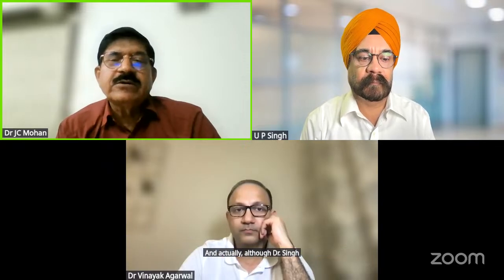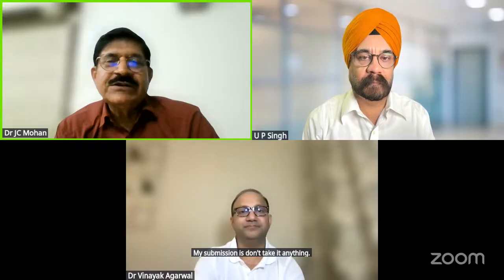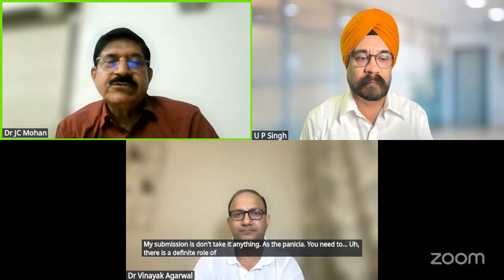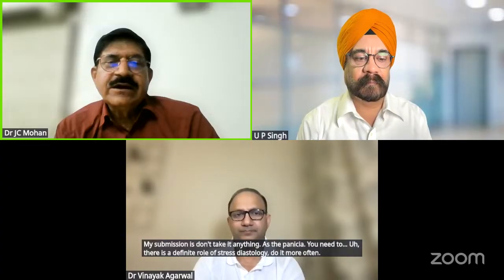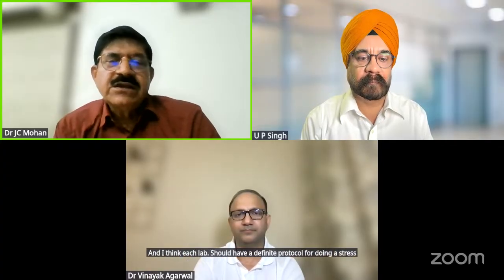And although Dr. Singh and Dr. Roberto Lang try to sell it as a magic bullet, my submission is don't take anything as the panacea. There is a definite role of stress diastology. Do it more often. And I think each lab should have a definite protocol for doing stress diastology in a good number of patients.